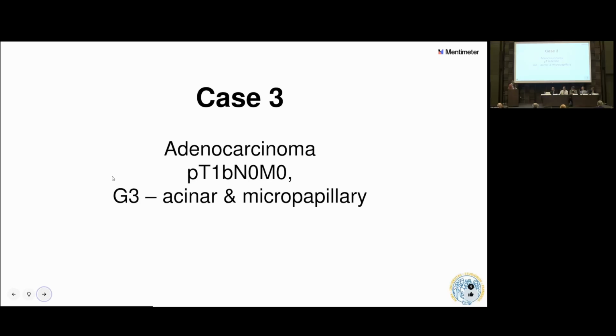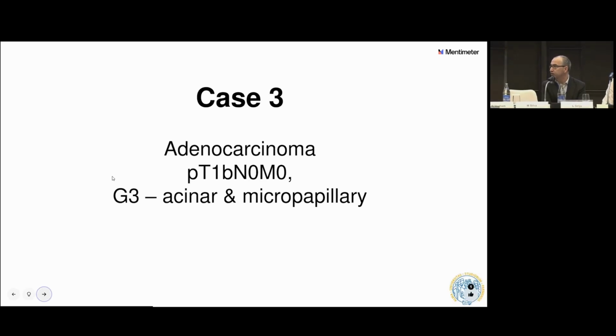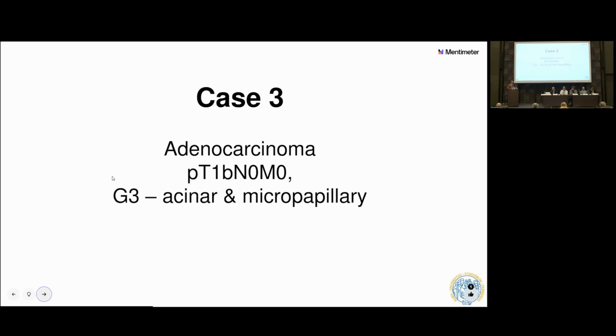Well, to me, the behavior just asks for either biopsy or resection. So I find PET CT scan in these smaller adenocarcinomas is not very helpful and can be misleading. So you get a lot of false negatives and maybe some false sense of security that you can wait and continue to follow a nodule like this when it's already behaved in a malignant fashion. Yeah, I agree. The PET CT for this case would have been low likelihood of positivity.